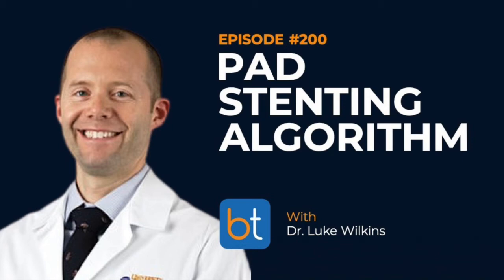And there are other devices that also use that boring technique, like a drill going through that atheromatous plaque. That mechanism is strong enough to make it through that plaque, but not so strong that it will exit the vessel wall. And the other method that they use is an actuating tip that will be strong enough to bore through that CTO, but not so strong that it exits the vessel wall.